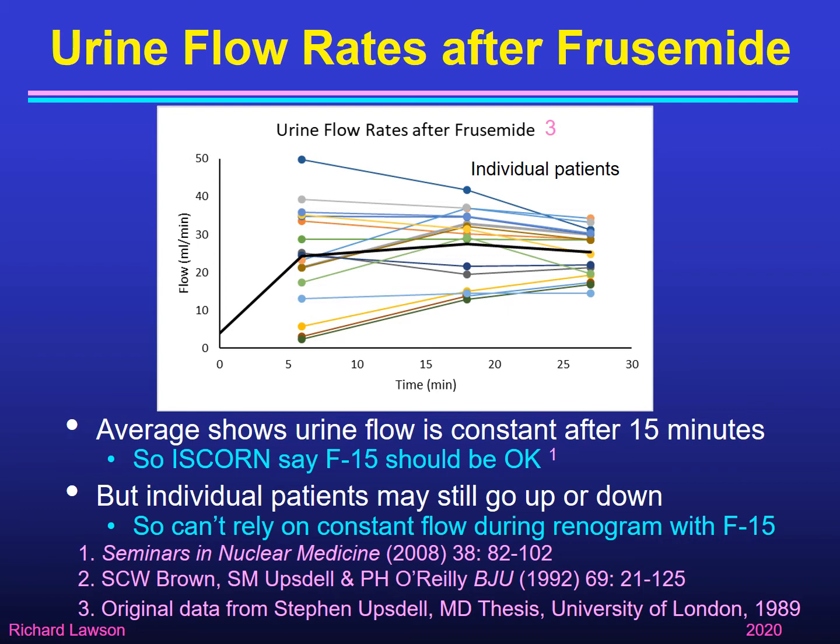So I am very wary of trying to apply deconvolution at any time after frusemide, and even with F-15 I don't think in any individual patient you can rely on the fact that the flow rate is constant, and therefore I don't like to apply deconvolution at any time after frusemide is administered.